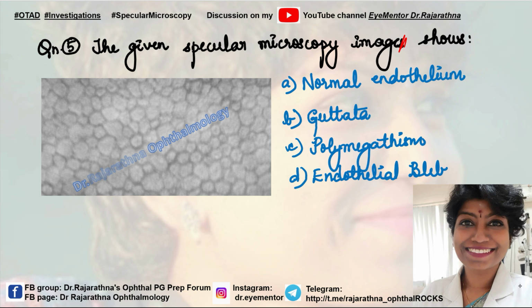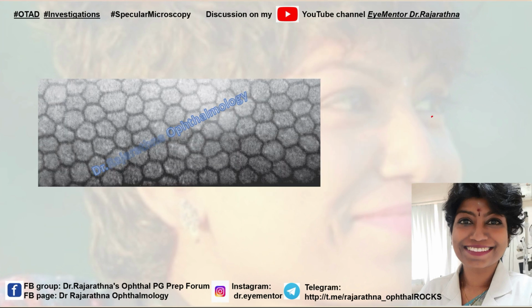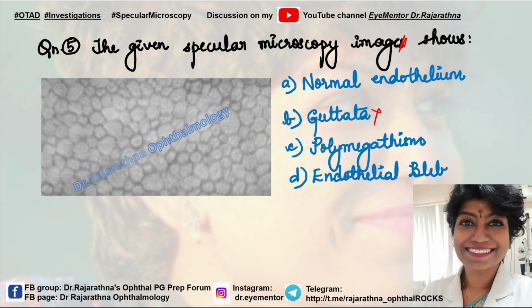Now question number 5. The given specular microscopy image shows normal endothelium, guttata, polymegathism, endothelial bleb. Now, one thing for sure you know is it is not guttata, because we have seen the image in one of the questions. So you know for sure that it is not guttata. And you've also seen me explaining a normal endothelium. So this is normal endothelium. I discussed this with another question. So now let's take a look at the image that I've actually given in question number 5.